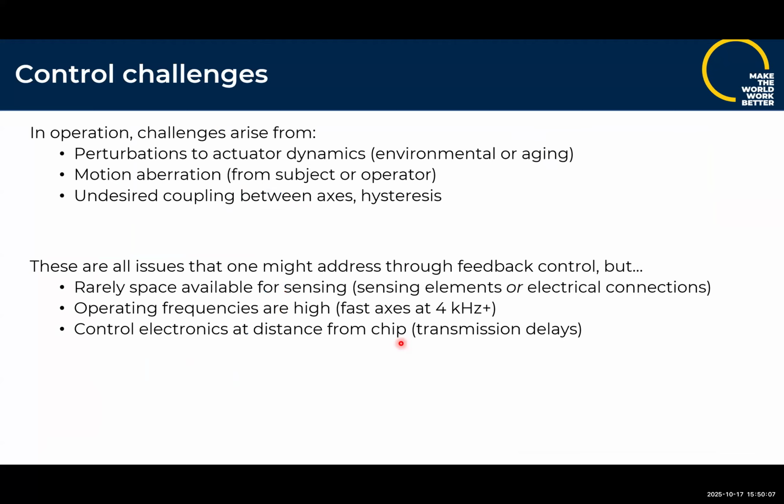One thing, if you were looking at the last slide and noticed it, the modeled frequency response of the system was well off the experimental frequency response, shifted by about 10% in frequency, in fact. And that's not unusual for our ability to control the fabrication processes behind these devices. What's more, as you perturb the environment due to temperature changes, humidity changes, even aging of the devices, we get further shifts in the natural frequency of the device. And that's quite bad for imaging registration, as one might imagine, or we'll come back to in a second.